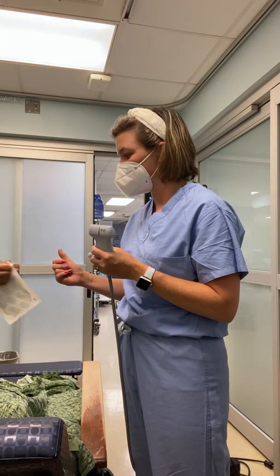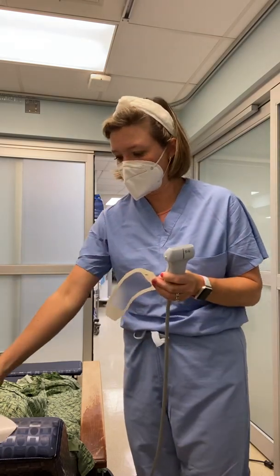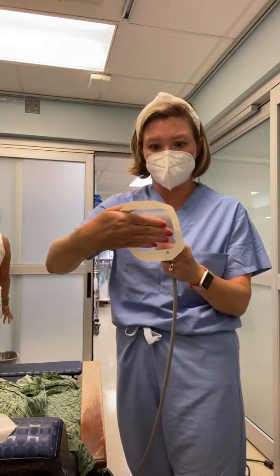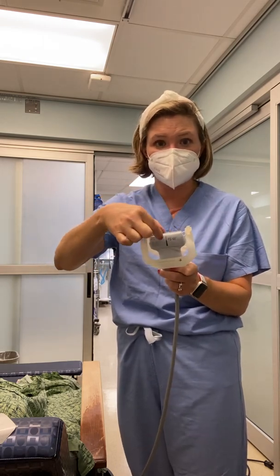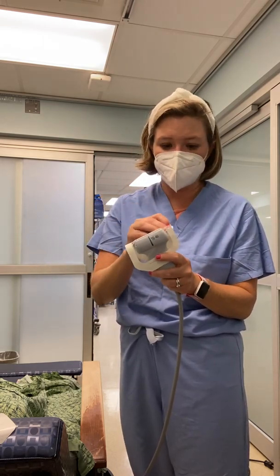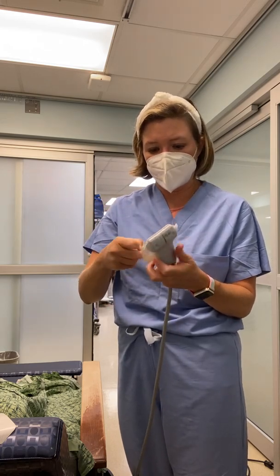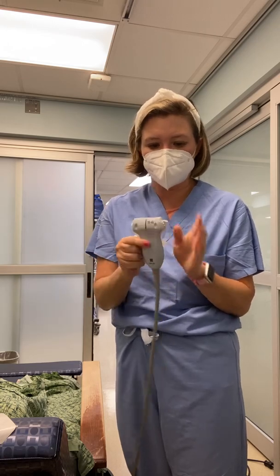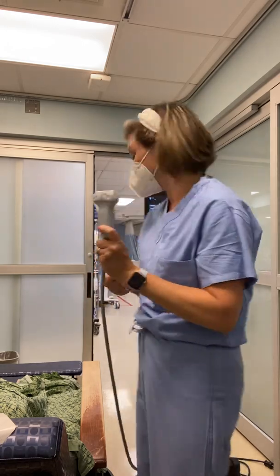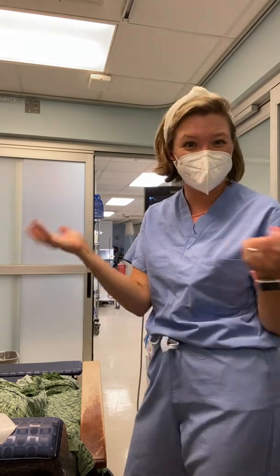You place the Tegaderm on the probe. You simply adhere it from either side, pull as snug as possible. Again, some like gel underneath that application. You peel away the border and adhere it as best as you can. You can then set the probe back on the machine, and it's ready for the procedure and the patient to arrive.